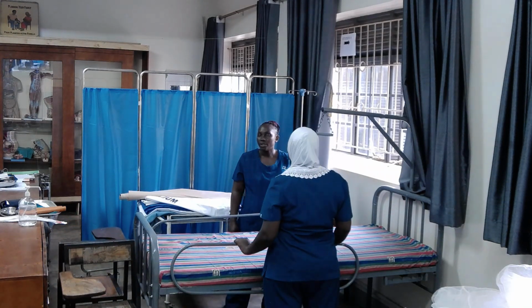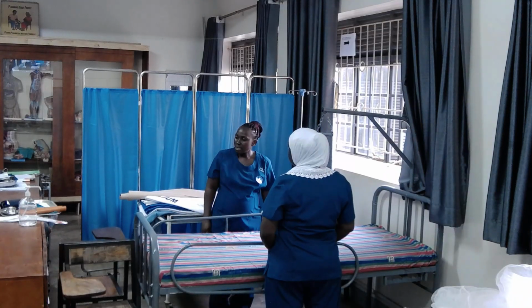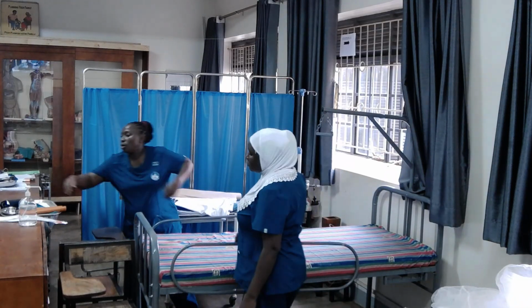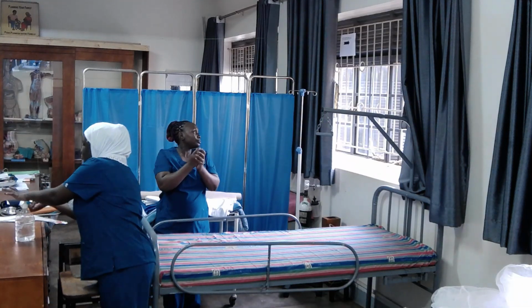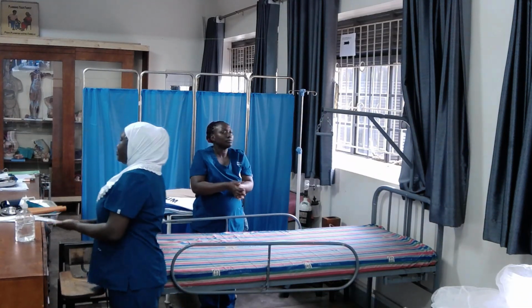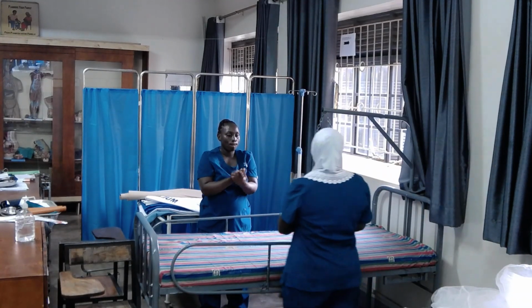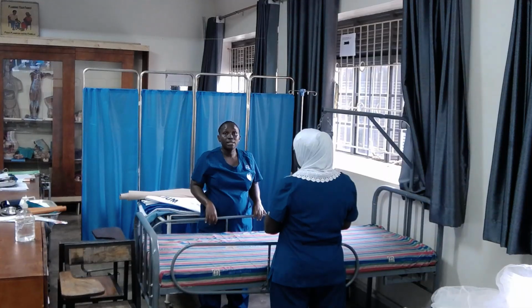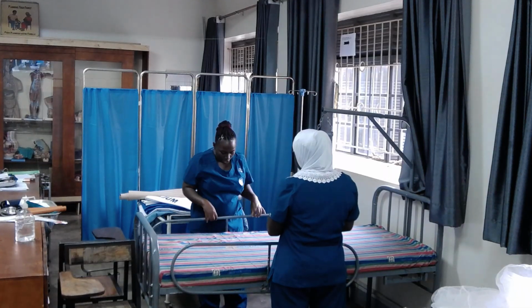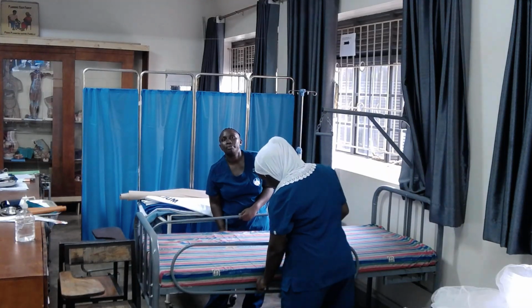Okay. So as usual, stand in the middle, but we need to first wash our hands to avoid contaminating or infecting. So these bed rails are needed for a patient with head injury, but because we're going to make the bed, we're going to first lower them.